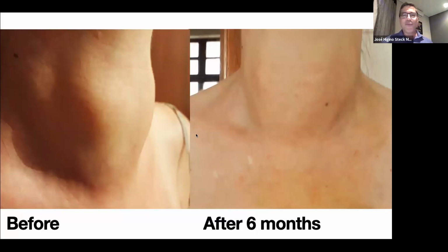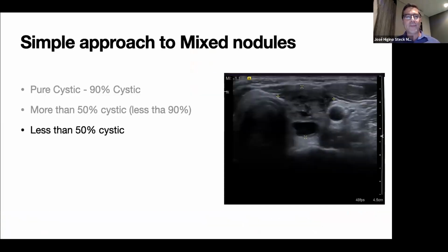And this picture, which Erivelto already showed, is of this patient with a huge mixed nodule before the ablation, and you can see a good effect after the ablation at 6 months. The nodule is still there, but the cosmetic effect is very good.